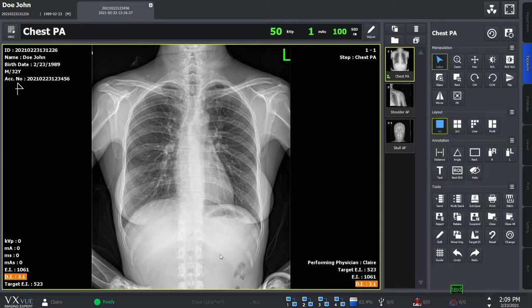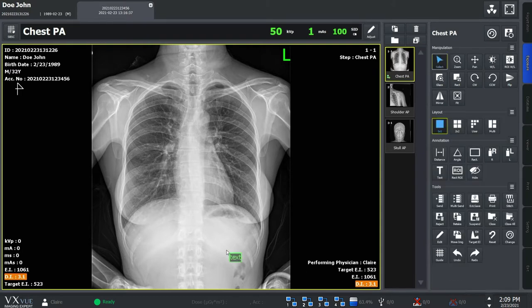You can locate the annotations anywhere on the image and adjust the size. At the setting mode, you can change the default font type, color, and size.